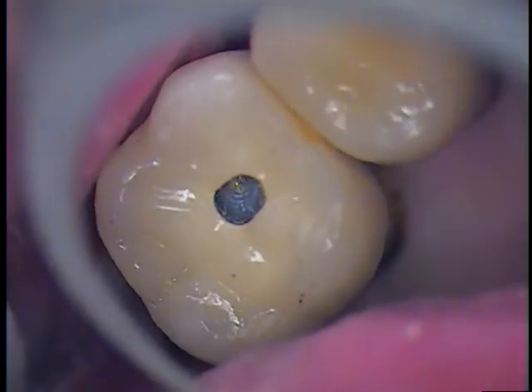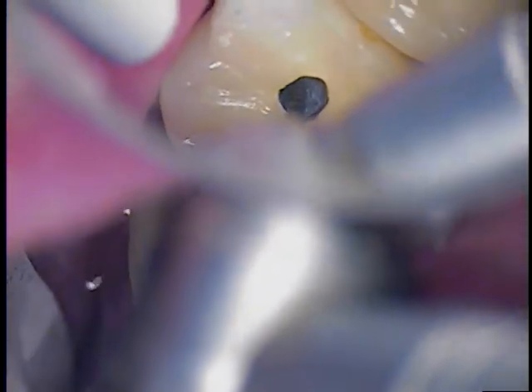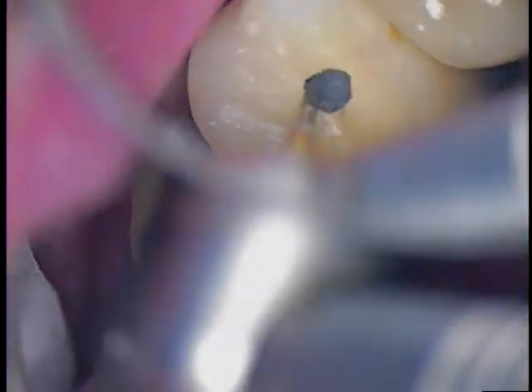So we have to do some uncovering here. This is where I'm going to take the water off and just use some light air. I'm just going to gently remove this composite. So it's more lingual and to the distal — I'm just following the dark hue. And it's toward the lingual and the distal.